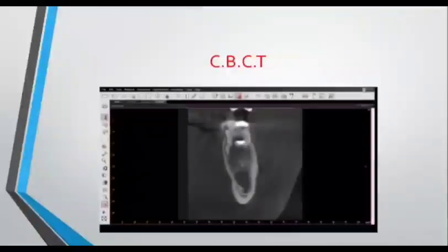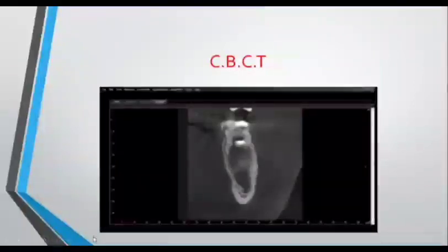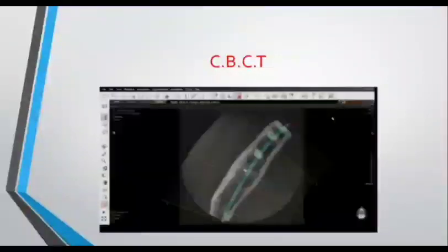I use 3.5 dental loupes as I don't have a microscope, but I couldn't find the orifice no matter what. I brought the light curing device, switched it on the lingual side, on the lingual wall of the tooth distally, and I just couldn't see the orifice. So I asked for a CBCT, and only then was I able to limit my search to a couple of millimeters in the pulp chamber floor.